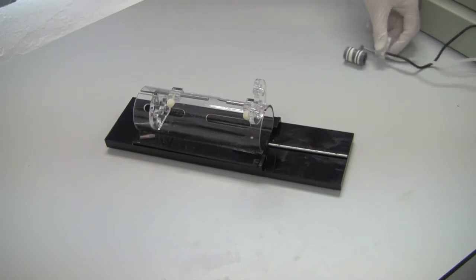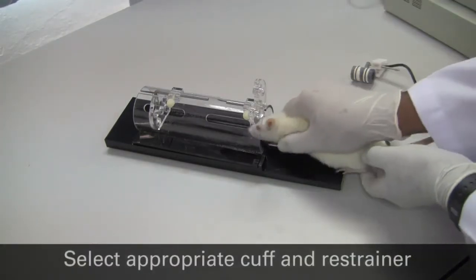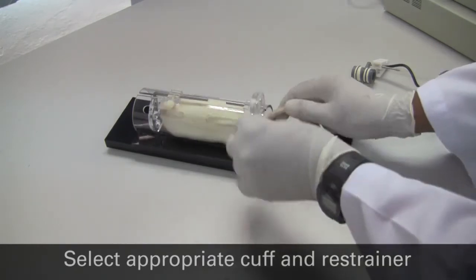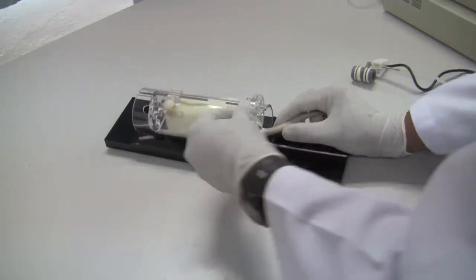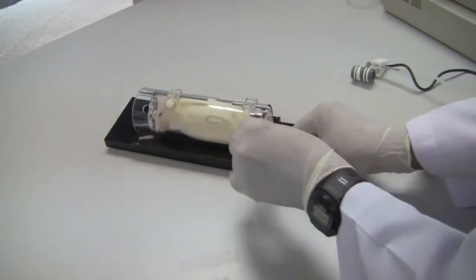Before performing blood pressure measurements, the subject animal must be introduced into an appropriately sized restrainer. In this instance, the rat weighs 210 grams and we are using the rodent restrainer for rats weighing 180 to 320 grams.